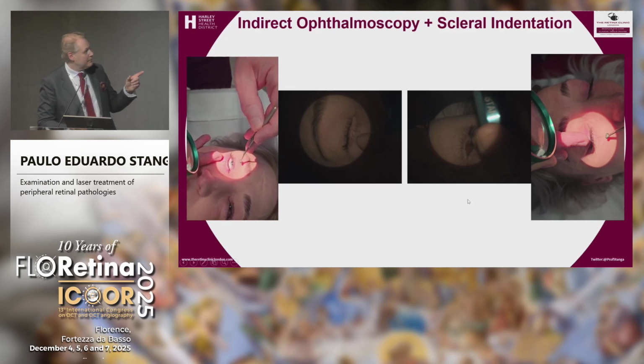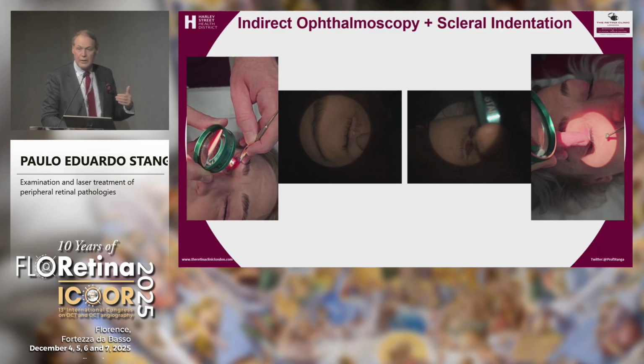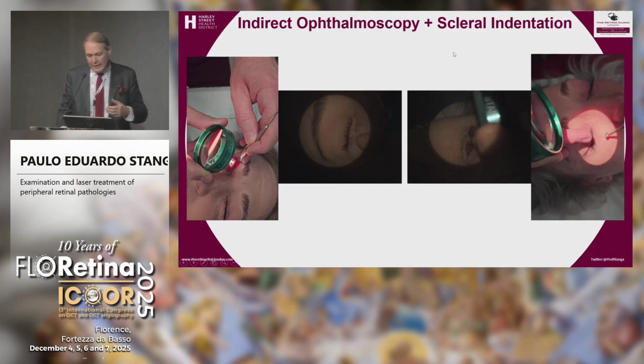And look at this, because this is important. There. You want to go there. You want to press on the edge of the cartilage. You don't want to press too deep because that's painful. You don't want to press too close to the eyelid margin. You want to press on the posterior edge of the cartilage. Okay? So that's exactly how I see it. And you saw that's not edited. And I end up, look, directly at the ora.